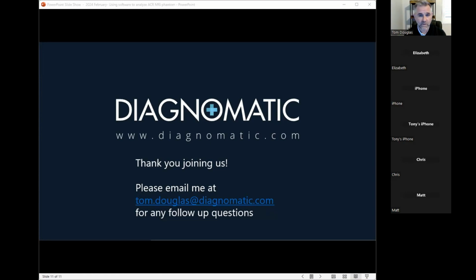And if you thought there was some stuff in here that was helpful, we are doing a recording of it, and we'll make that available as well. So if you think it'd be worthwhile to share with somebody else on your team, or a customer or end user who might be interested, you can get that to them and give them a quick and dirty demo.